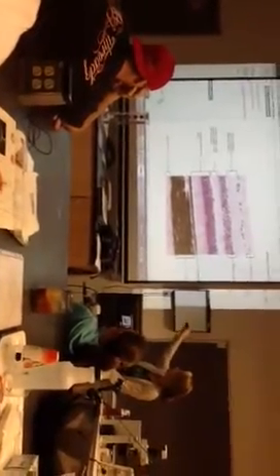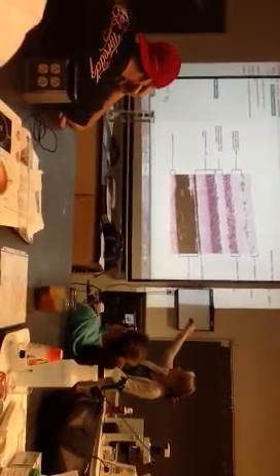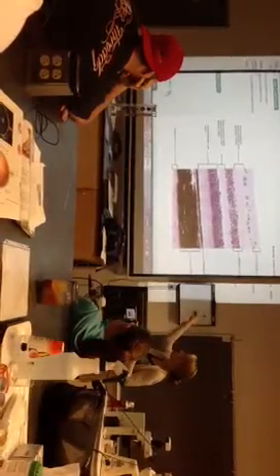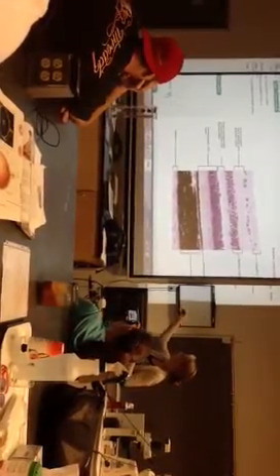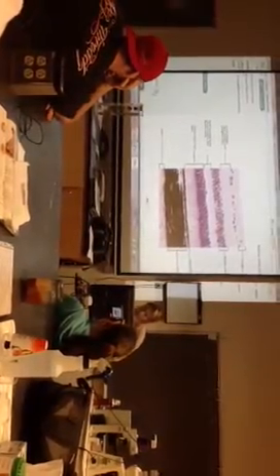This one is cool because it shows all of the cells that are involved, and that's all part of the retina. But then we also have this very tiny sub-layer of the retina, that's the pigmented layer. You may not have been able to see that in the slide because it just runs in next to the choroid. So it's cool that you can see that here. And then here's the choroid, really dark pigmentation there. Retina.